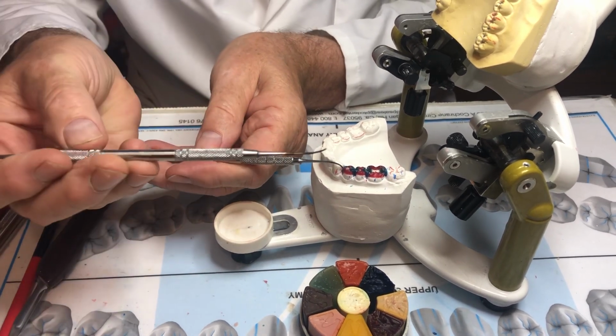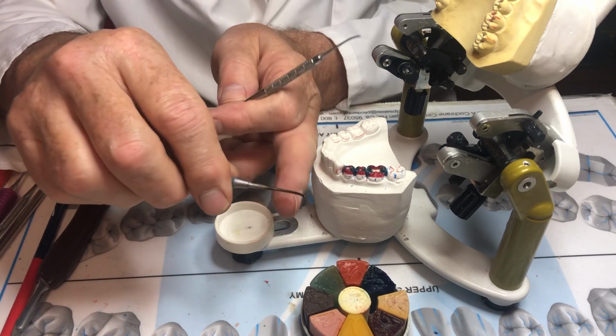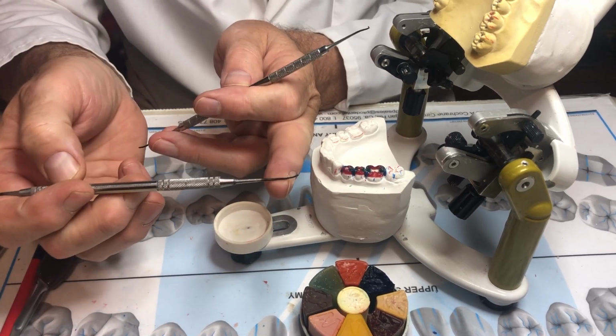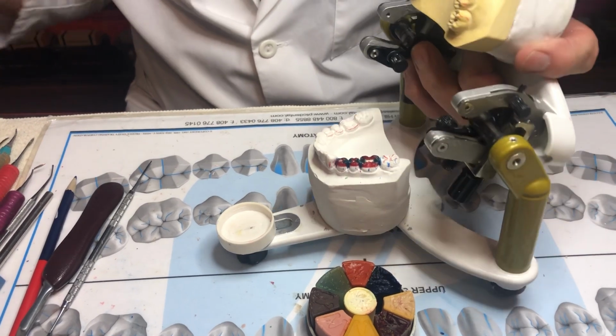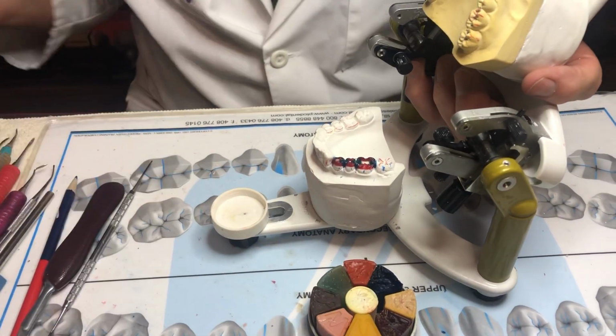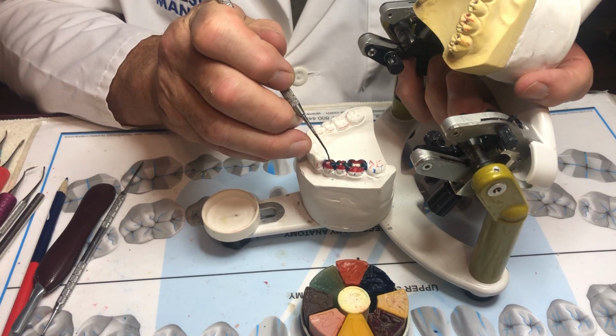So if this is what you have, bring it up and I can change yours from a fat tip. I'll grind it so you have a nice skinny one. It'll give you smaller drops. There'll be no changing. There'll be nothing to correct, and everything will come out right the first time.